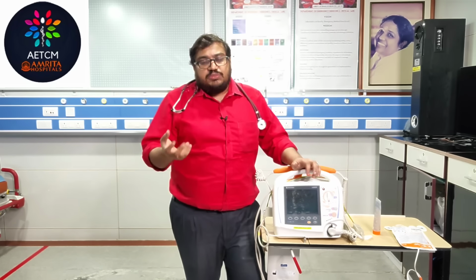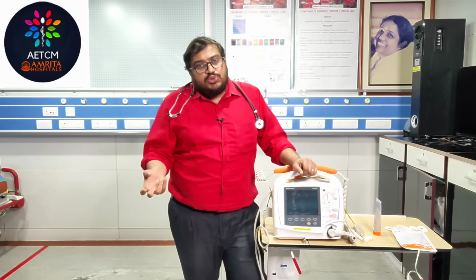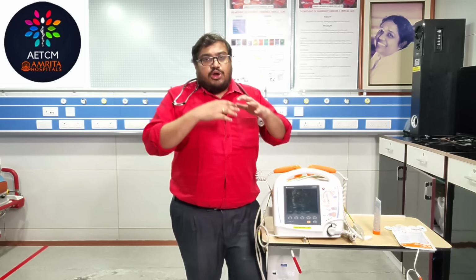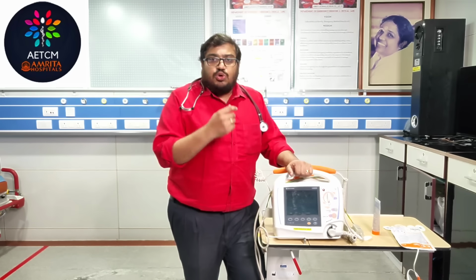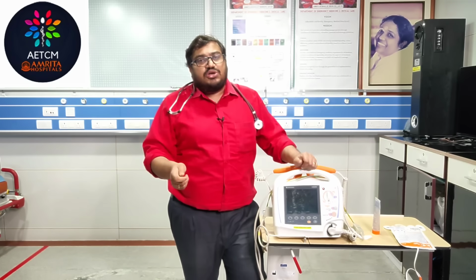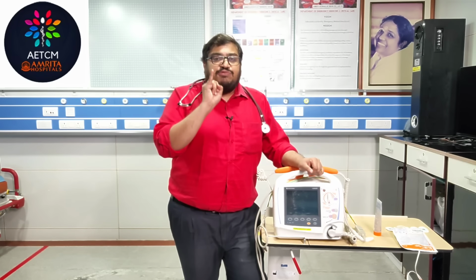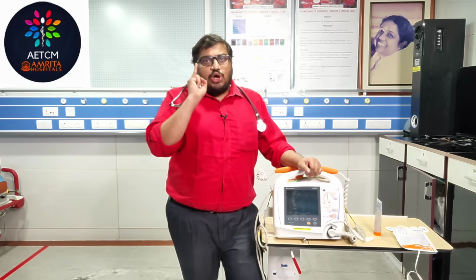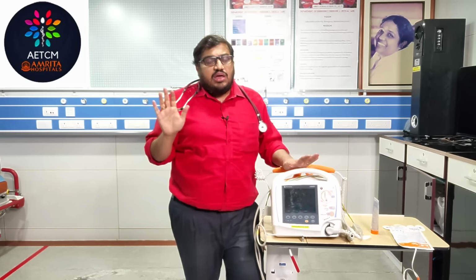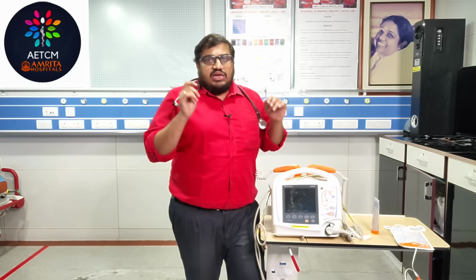Again the question comes, what is the energy that you need to select? Always remember, defibrillation is 200 joules if it is a biphasic defibrillator. If it is a monophasic defibrillator, 300 to 360 joules. If you are not able to remember these joules, just go to your defibrillator, take the maximum amount of energy available in the defibrillator and deliver the shock in case of a defibrillation. So remember, we use defibrillation only in case of a shockable rhythm in a cardiac arrest, that is pulseless VT and ventricular fibrillation. That's all regarding defibrillation. There is no synchronization, there is nothing else. We are just selecting the energy, that is the maximum amount of energy.